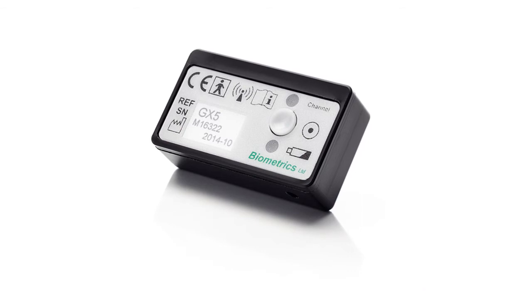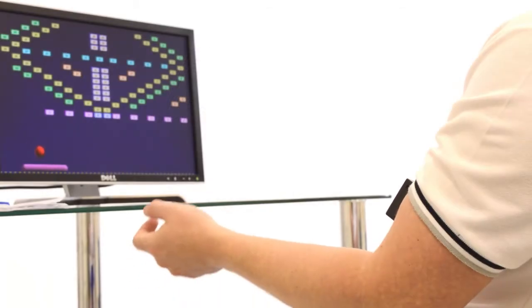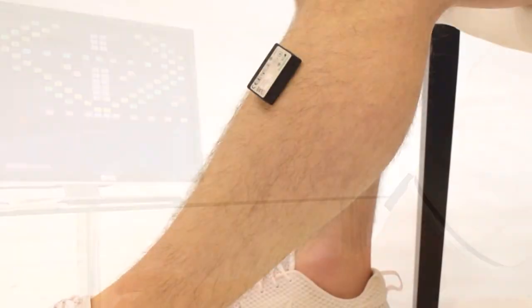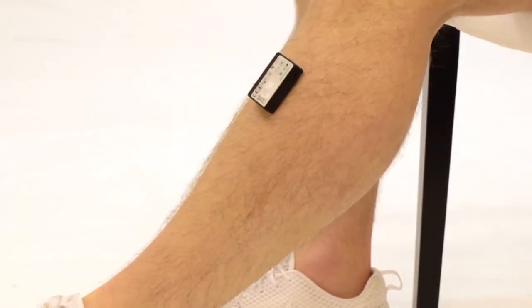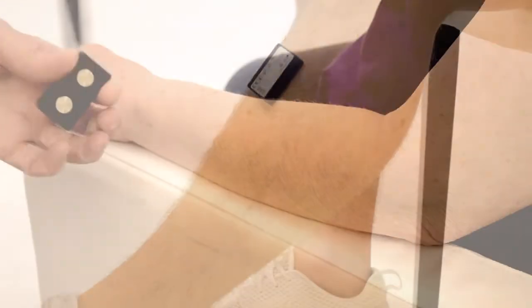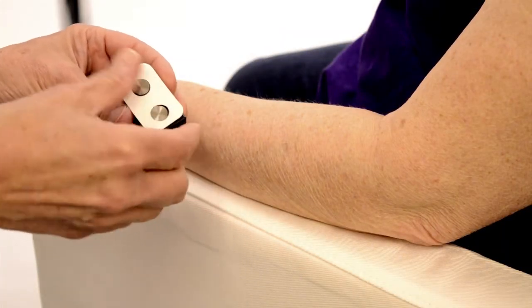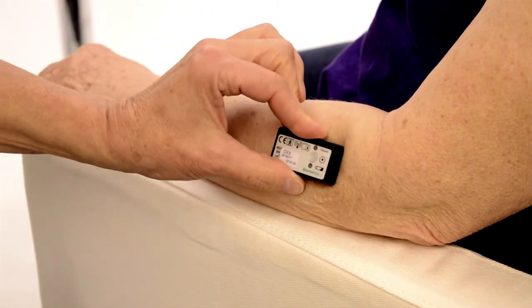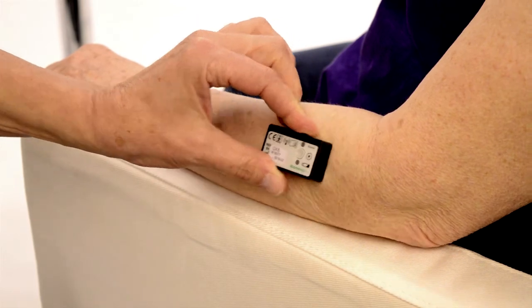MyoX is a very practical, easy-to-apply solution when seeking to address issues of muscle activation — not only for the extremely debilitated patient, but for all patients through to professional athletes. Simply applied with medical grade tape onto the skin surface over the muscle to be exercised, the wireless MyoX sensor is quick and easy to apply.